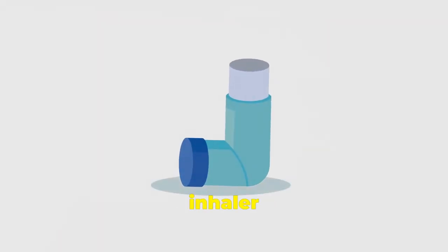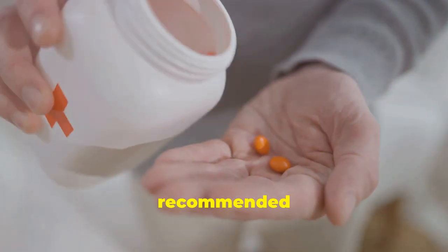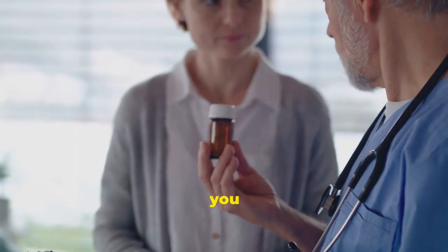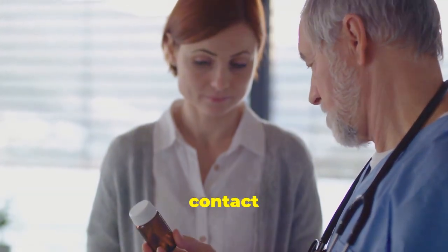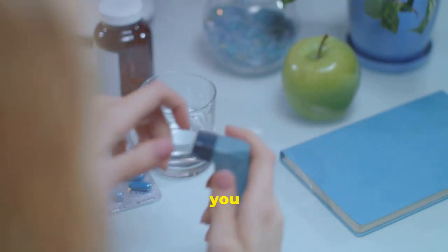Remember, each inhaler and each spacer follows its own recommendations for care and use. Do not take more doses than recommended by your doctor. If you feel that you need to take more, contact your doctor. And always remember to take your inhaler and your spacer with you in case you need it.